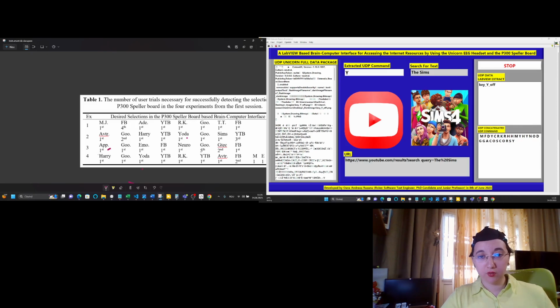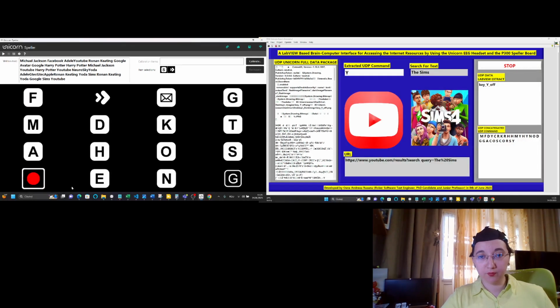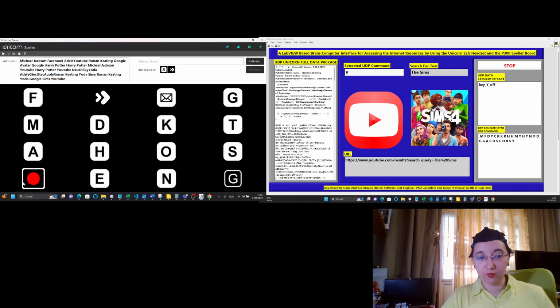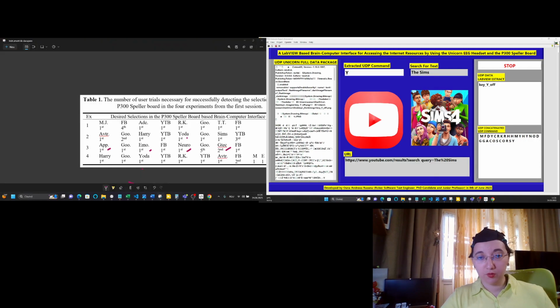So this is A from Apple, then E from Emotiv, then Neurosky, and then g.tec. So these options are from the last row, from the fourth row. So firstly, Apple will be searched for in Google.